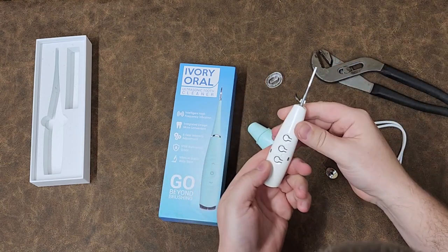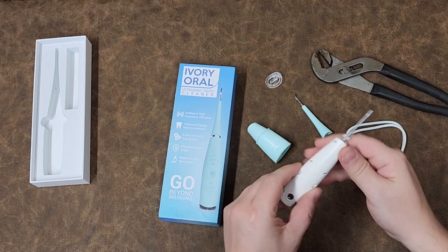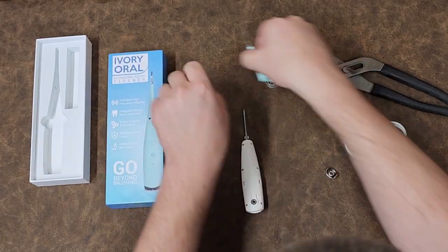There we go. You can see the activation buttons — they're just molded into the case. Very simple construction.